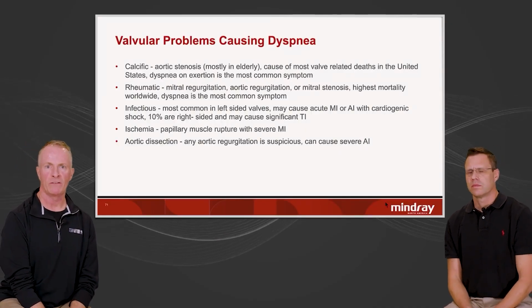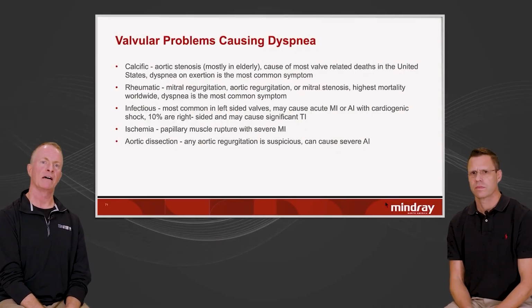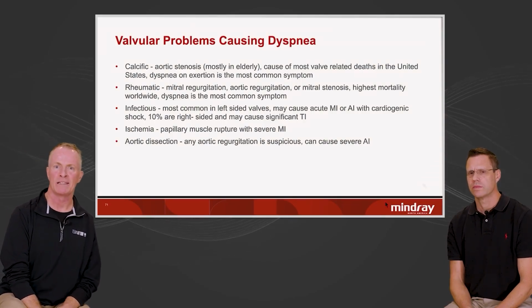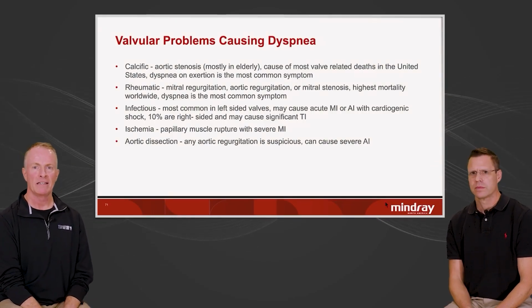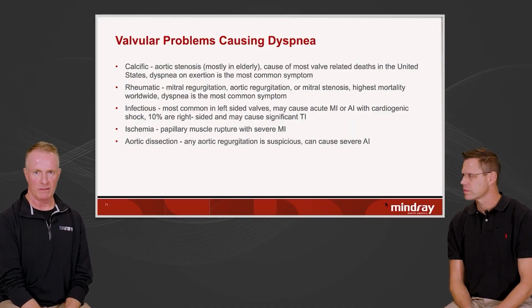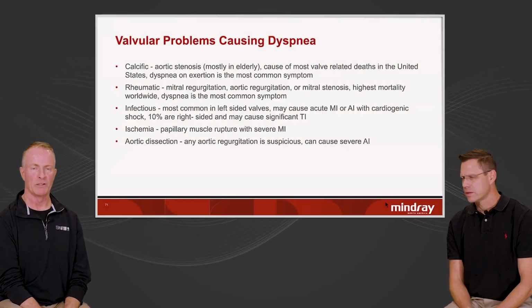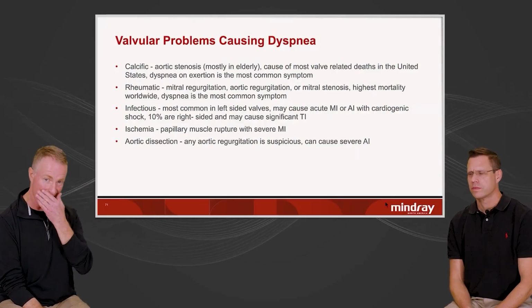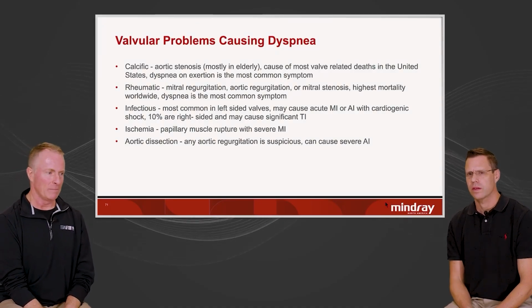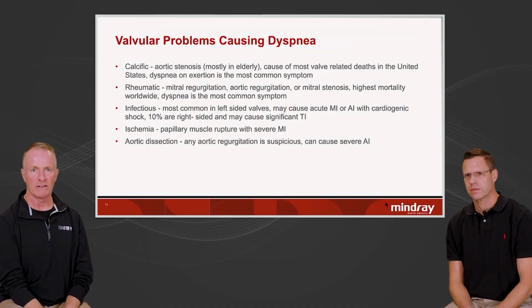Okay, so let's go on to valvular problems causing dyspnea. Most valvular problems, the number one symptom is dyspnea. So that's good to know. We don't think about that very much, but I'm sure if you're an experienced emergency physician, you've seen that. You thought you were dealing with someone with a bad LV, and they have a bad mitral valve.